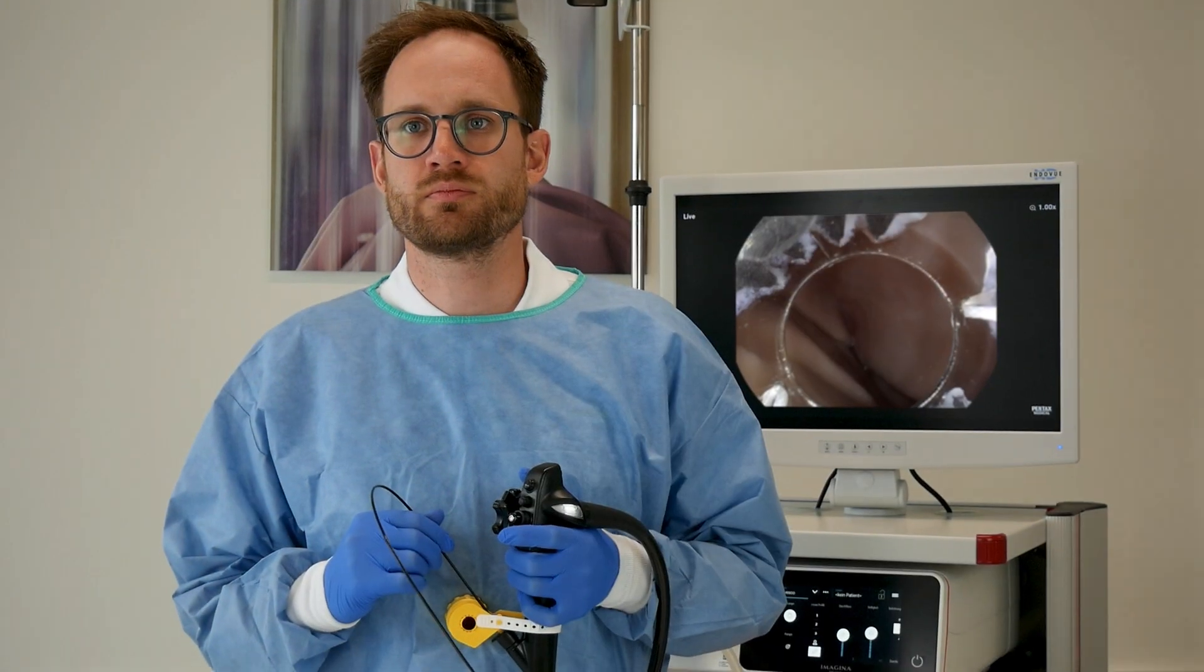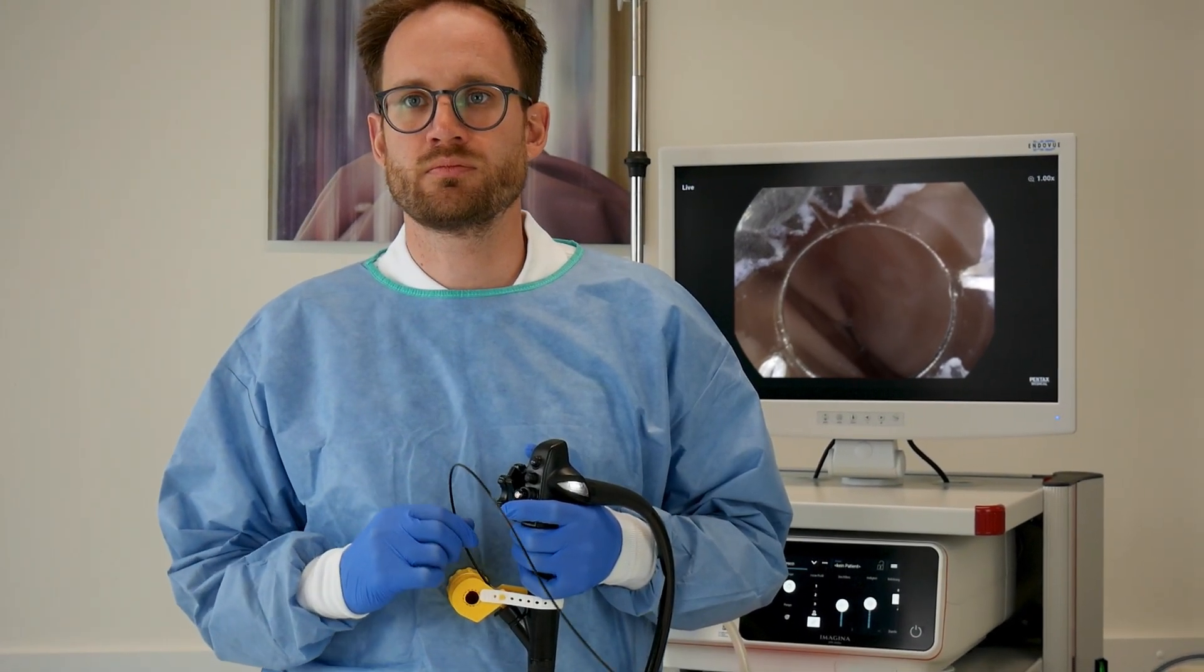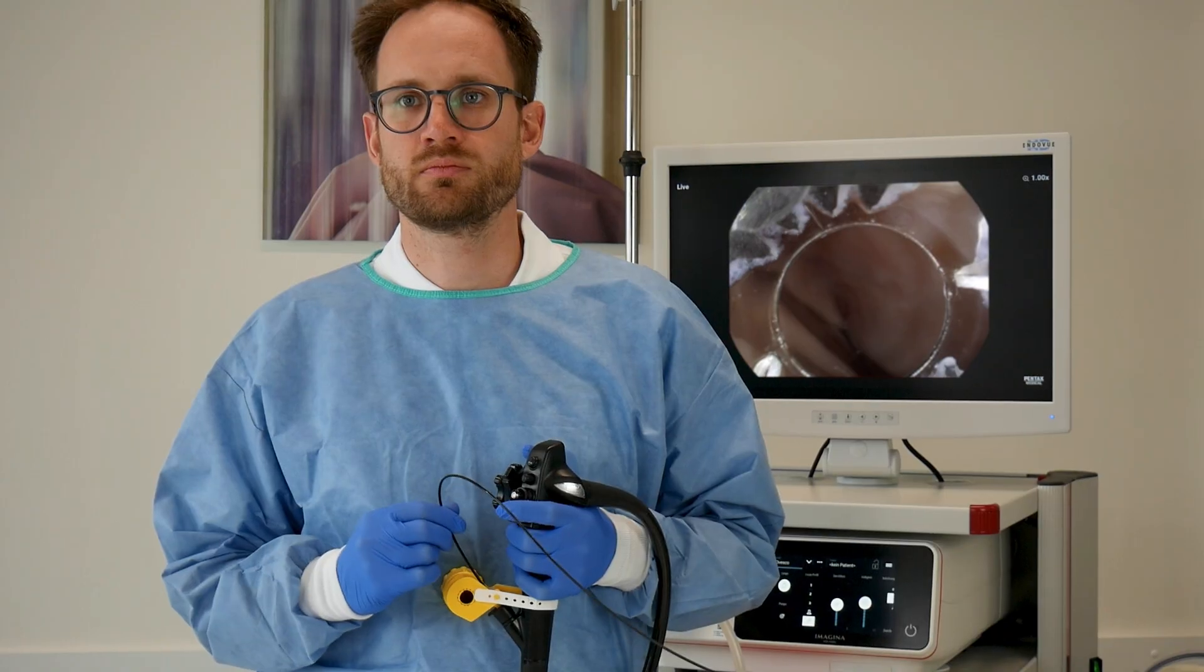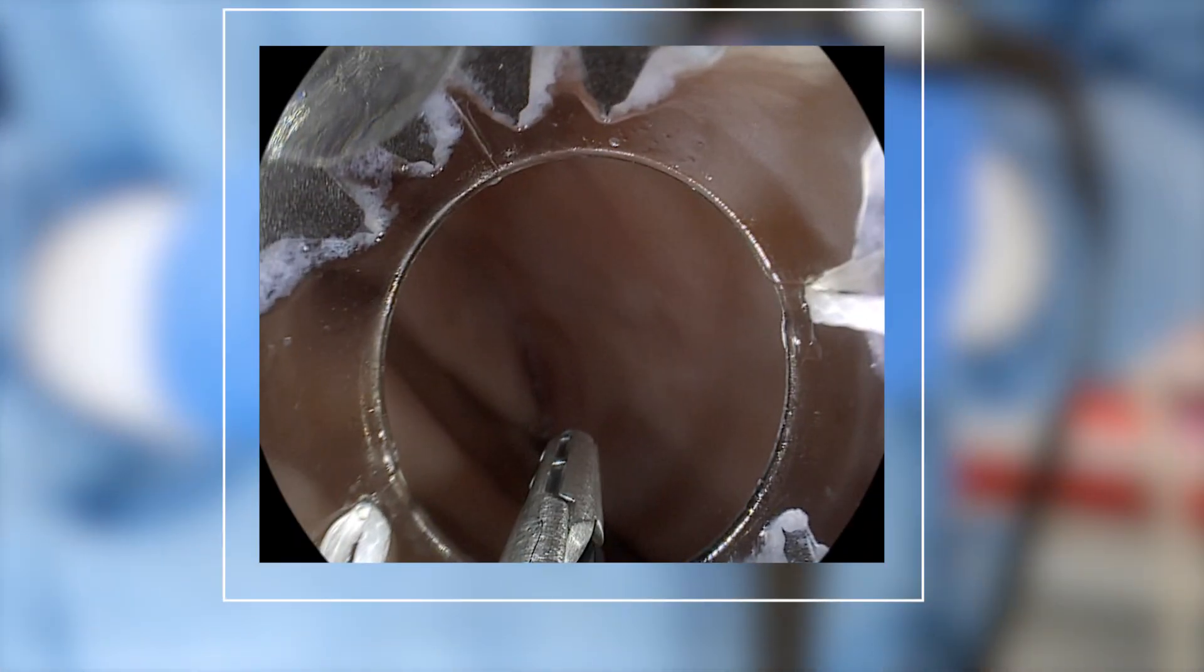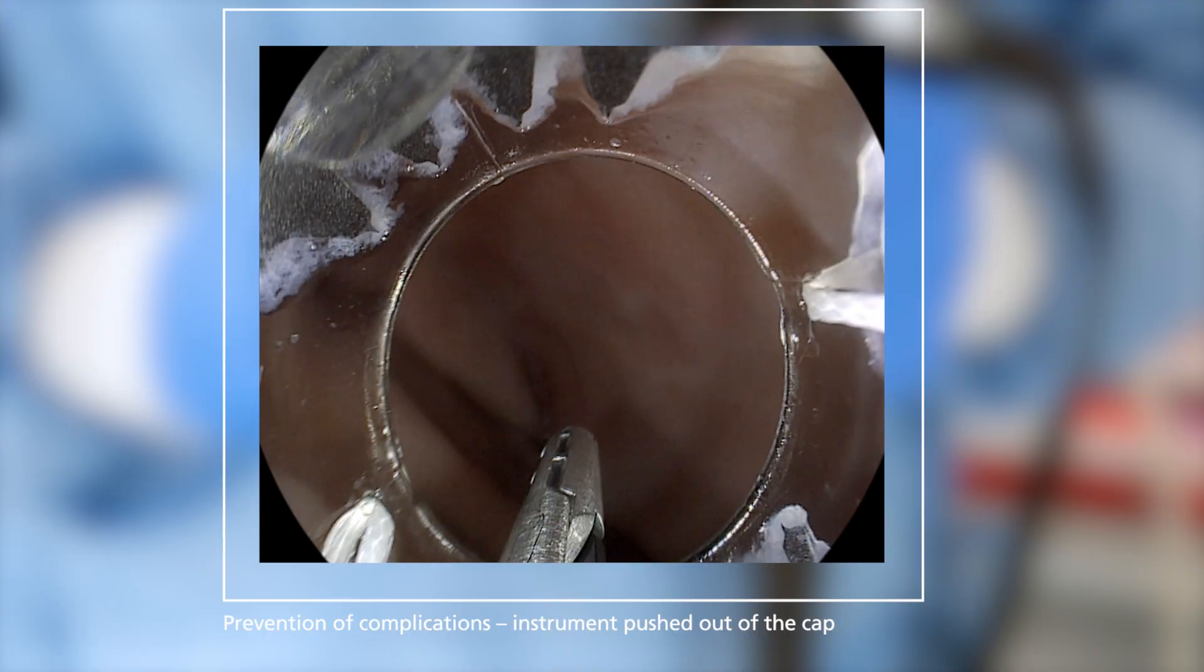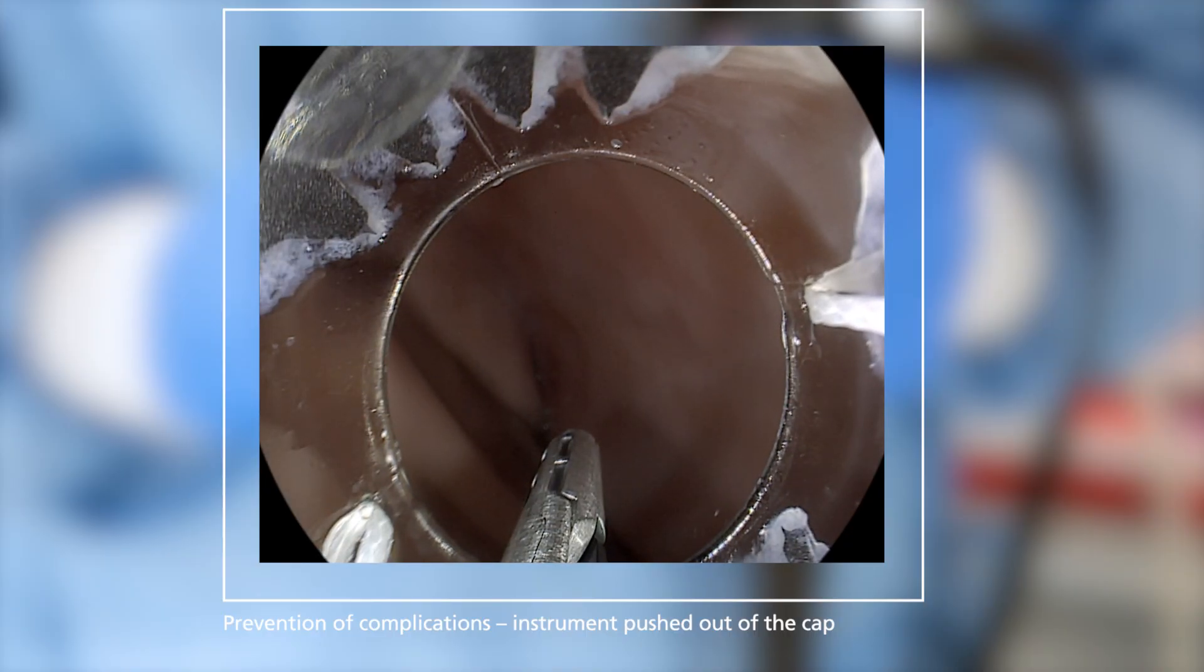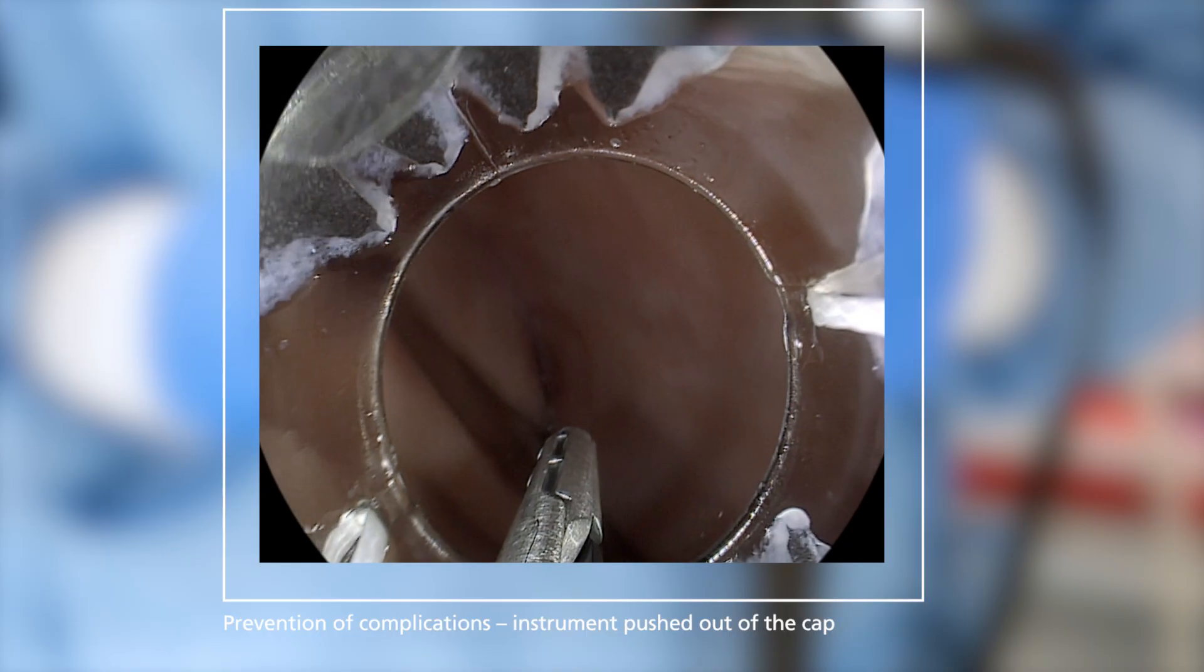If the clip could not be deployed, insert an instrument into the working channel before withdrawing the endoscope so that it protrudes slightly from the application cap. This serves as a safety measure to avoid complications in case the clip is accidentally deployed while withdrawing the endoscope.